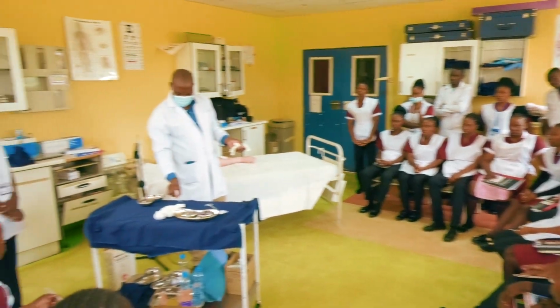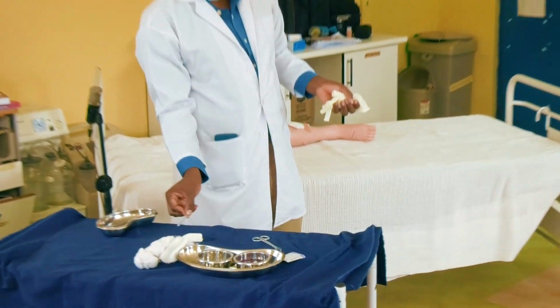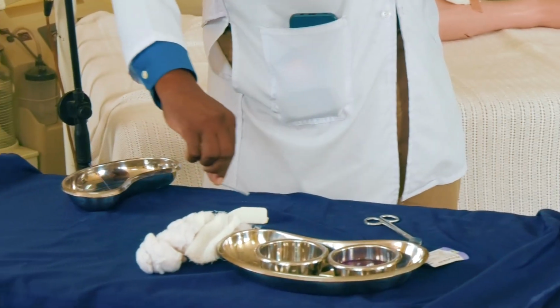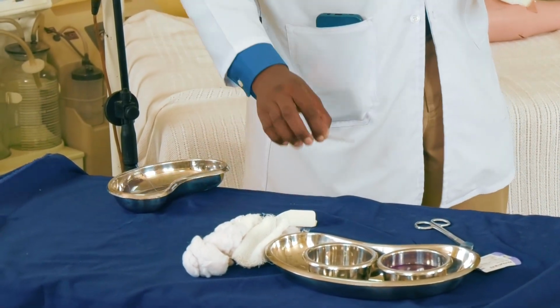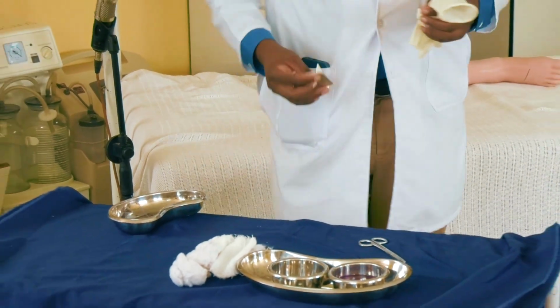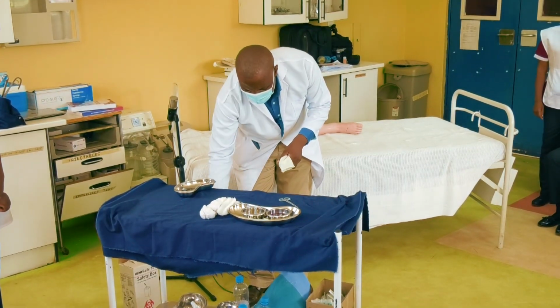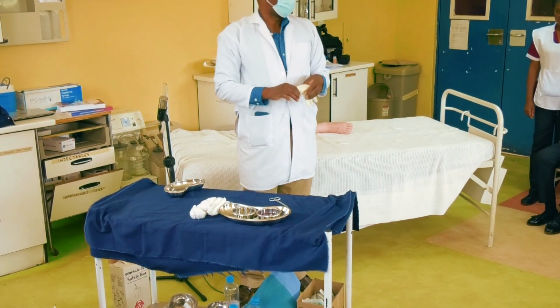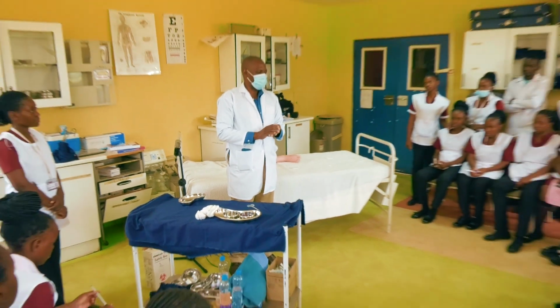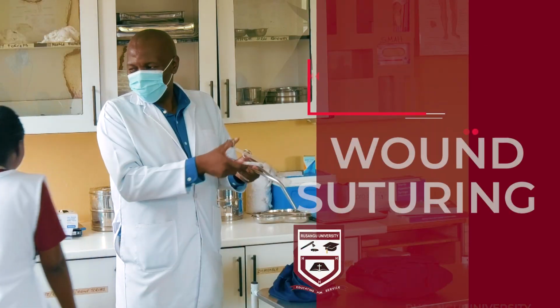Now I'm infiltrating right under the skin, so 45 degrees is okay. You infiltrate the area, wait for 3 minutes like we said, then when the area is numb and the patient is not going to feel any pain, you can start. Okay? We have no more questions.